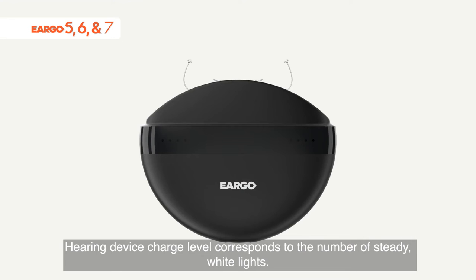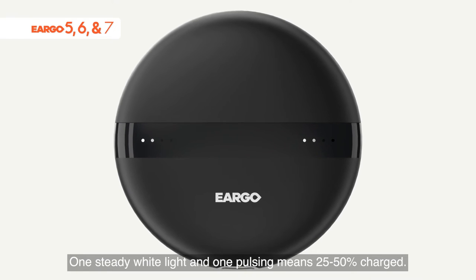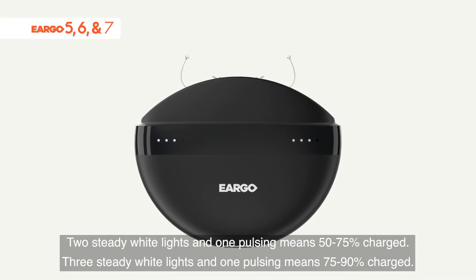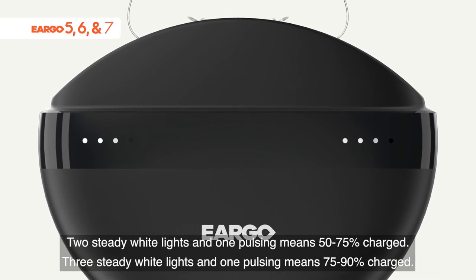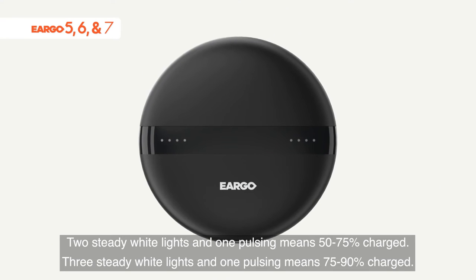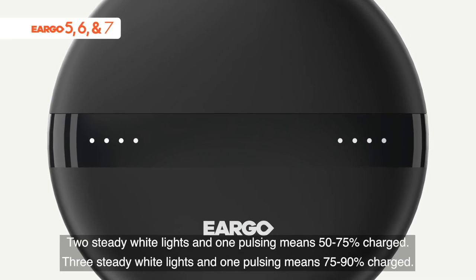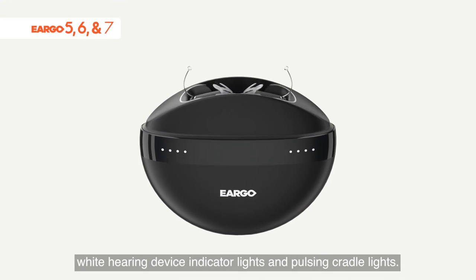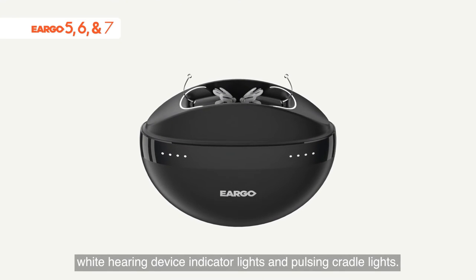Hearing device charge level corresponds to the number of steady white lights. One steady white light and one pulsing means 25 to 50% charged. Two steady white lights and one pulsing means 50 to 75% charged. Three steady white lights and one pulsing means 75 to 90% charged. When fully charged, you'll see four solid white hearing device indicator lights and pulsing cradle lights.